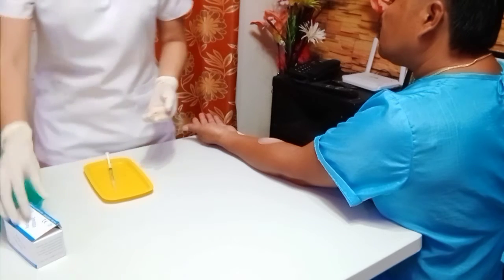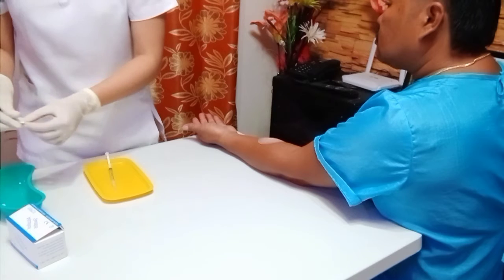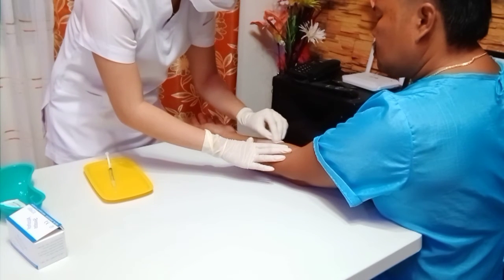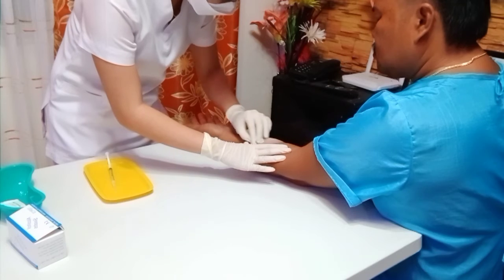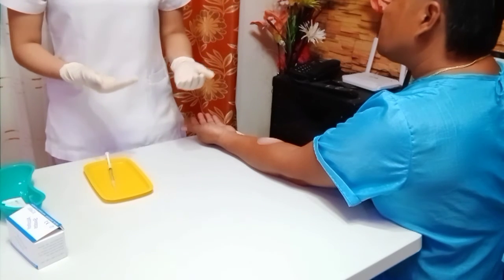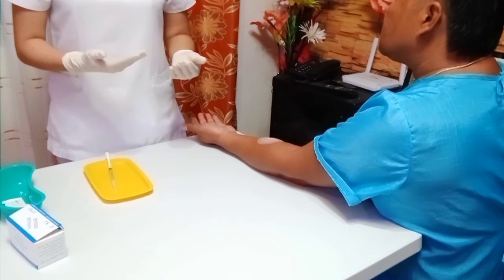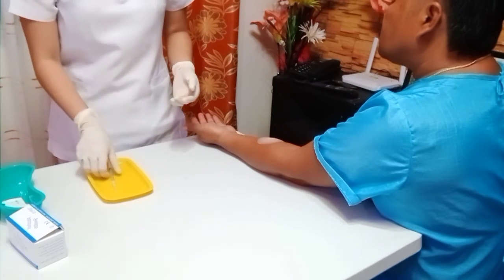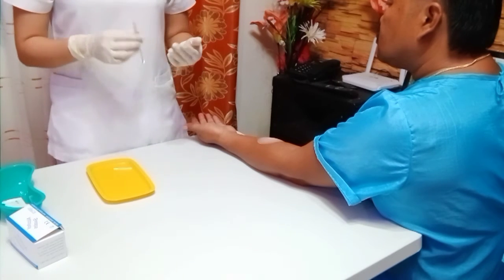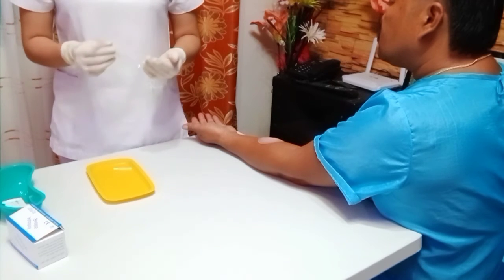Next is to clean the site with an alcohol swab. This is done to remove pathogens away from the injection site so as to prevent contamination. Next is to remove the needle cap while waiting for the alcohol to dry, since it might take a while for the alcohol to completely dry.